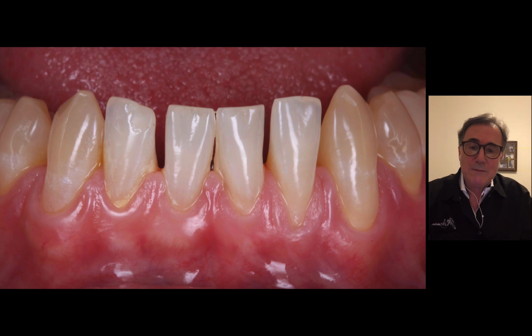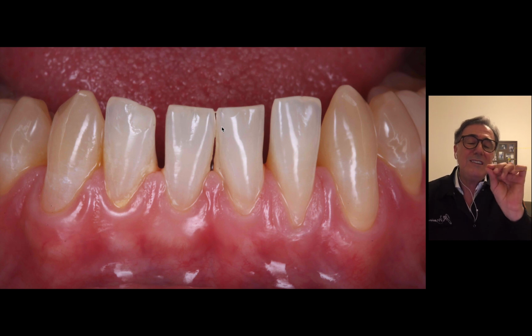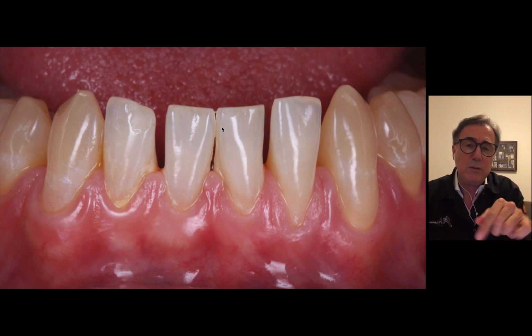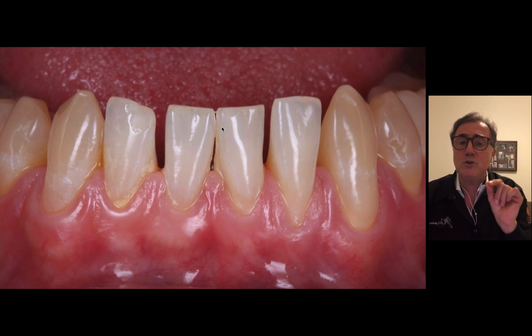This is case number one. Case number one is a diastema closure that we're going to do between the centrals and the laterals, and also a small black triangle closing space that we're going to do right over here. You can't see that. That probably looks like a very small black triangle, but because you have a lot of calculus around those teeth, it is actually a little bit larger than that, and it's something that bothers the patient. And these types of restorations are very hard to do if you don't have the proper tools.